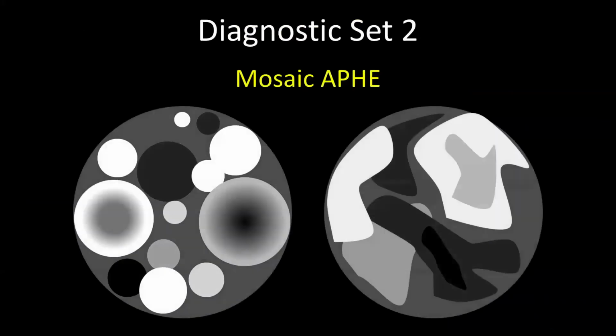No, the next 4 are much, much shorter. So let's start with mosaic enhancement. What do I mean by mosaic enhancement?